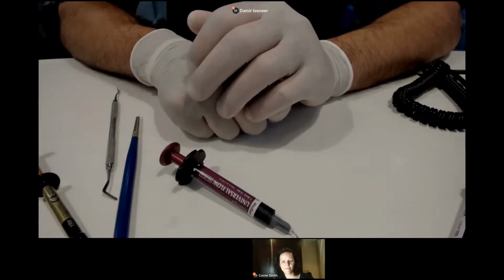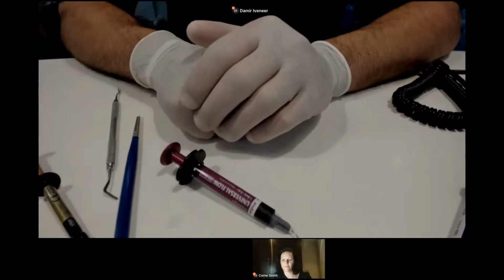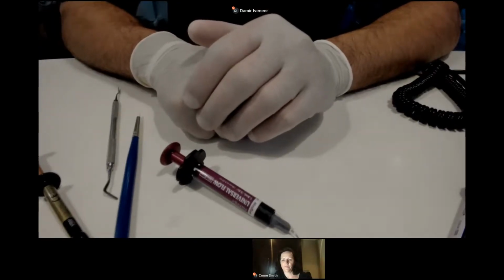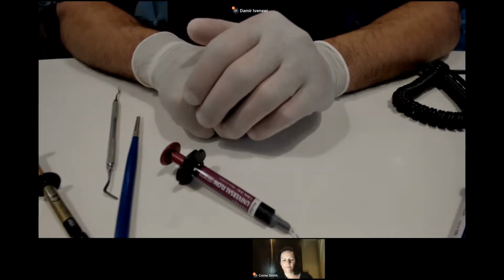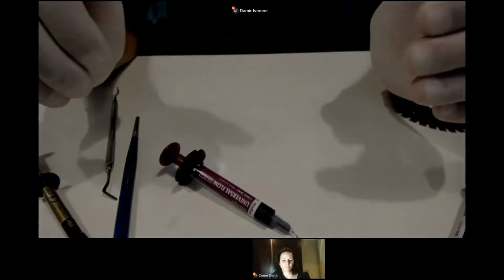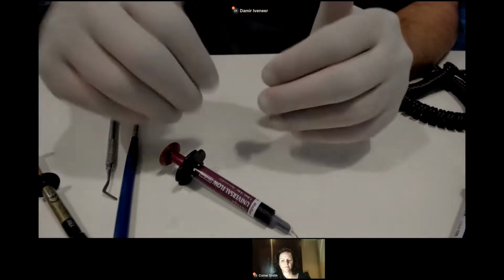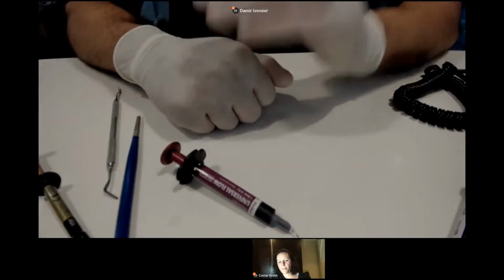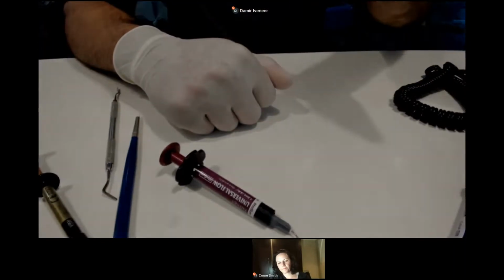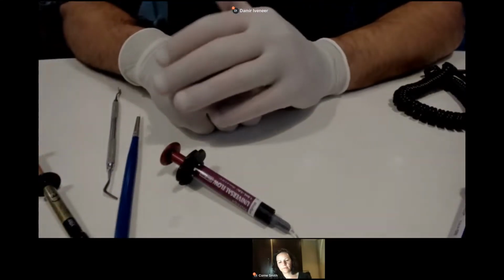I put composites. So I increase the occlusal vertical dimension with composites to compensate. And lateral movements, of course. But I do the composite veneers. And after I finish the composite veneers, I start to work on the movements, and I check the movements, and I'm doing reduction according to the movements. And for me, it works.